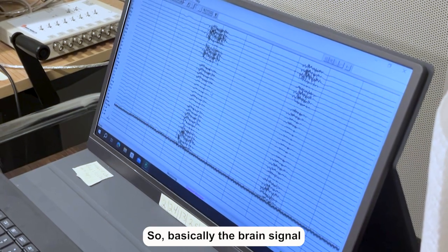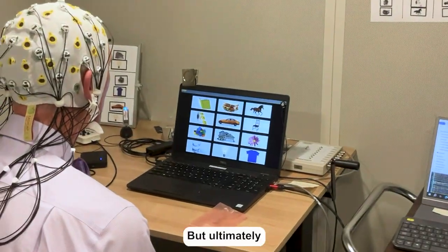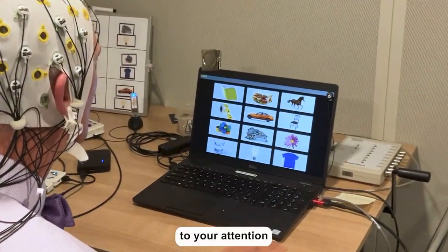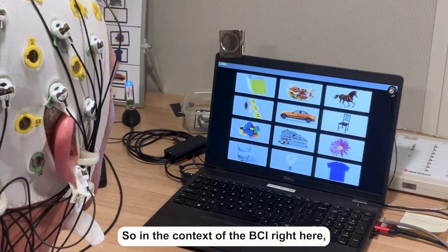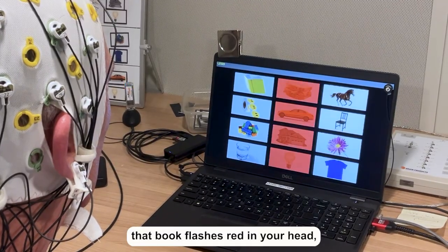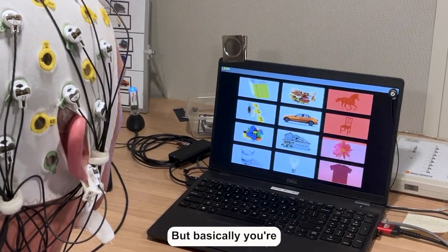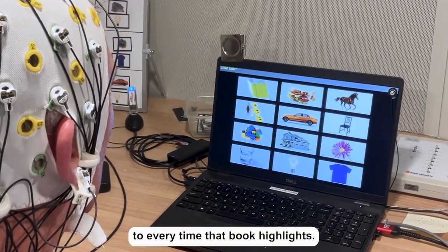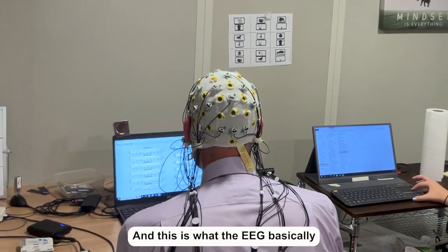So basically the brain signal that we're looking at here is a brain signal known as the P300. But ultimately the P300 is just related to your attention and that aha kind of moment. So in the context of the BCI right here, you're looking and every time that book flashes red, you're counting silently in your head or making a noise, but basically you're just paying attention to every time that book highlights. Then this is what the EEG basically then looks like.